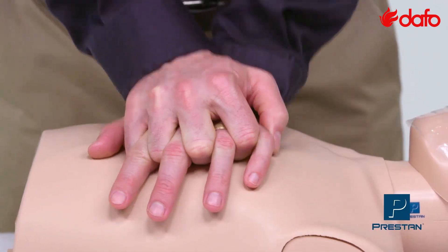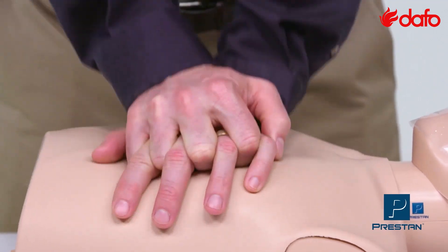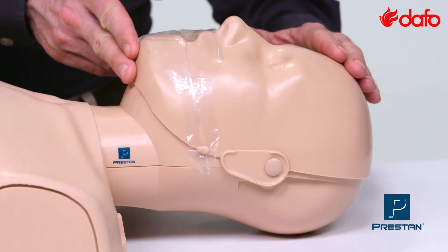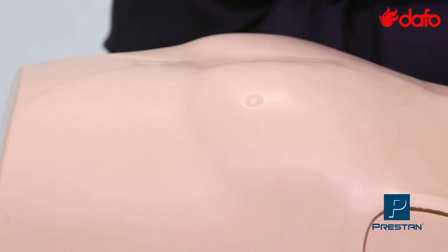It has been tested to over a half a million compressions for durability. In fact, it is so durable it is backed by a three-year guarantee. These mannequins offer an accurate head tilt while the lung bag gives a visible chest rise.